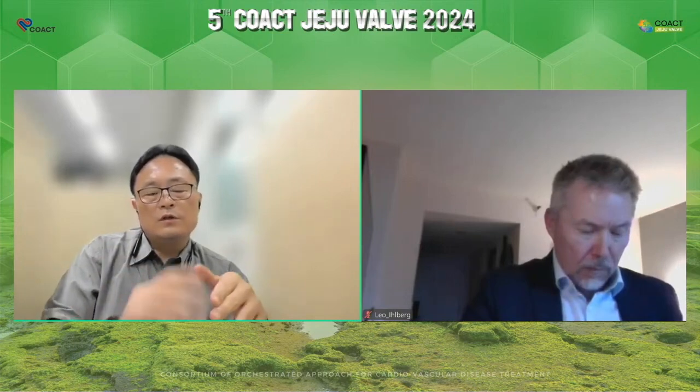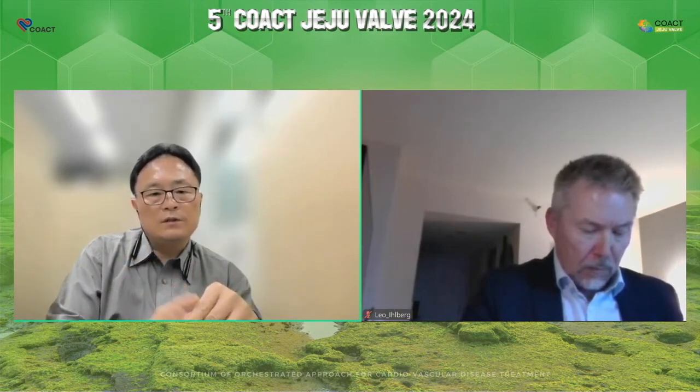And as you said, the post-dilatation method may cause a problem in future valve durability, but this is the trade-off between leaving mild to moderate PVL and thinking about the long-term valve durability.